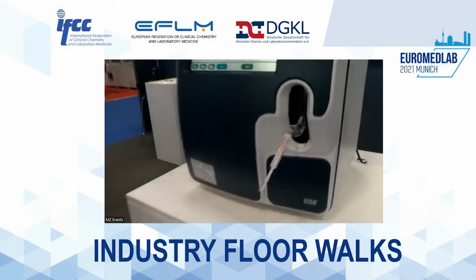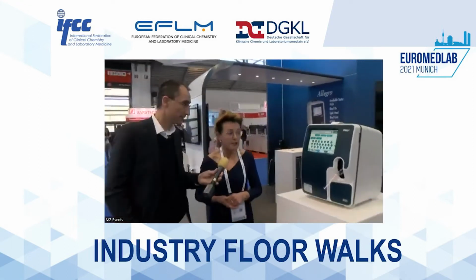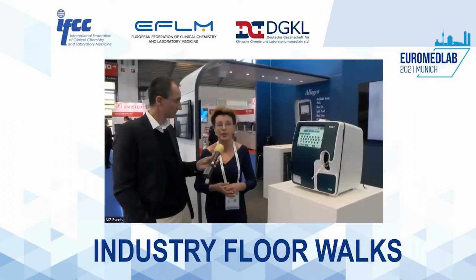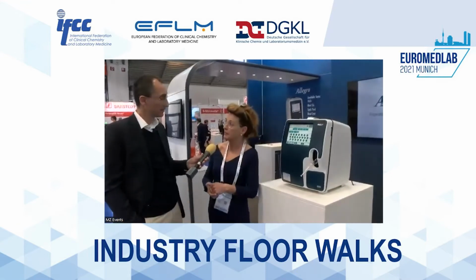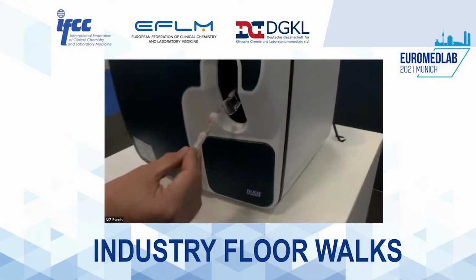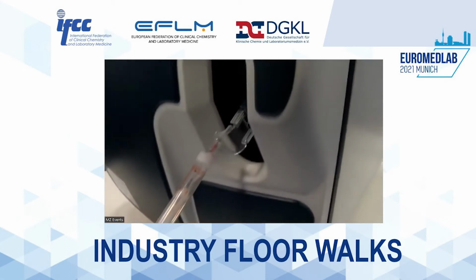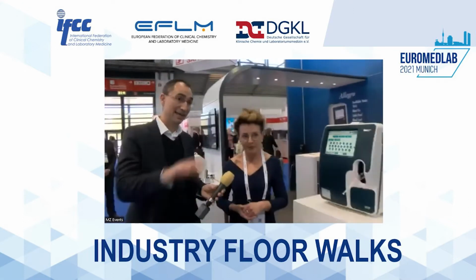Exactly. So can you tell me a little bit about the specimen you can use for this analyzer? It's made for whole blood samples, venous or capillary samples, arterial samples. That's good to see. Okay, and I think you're using a standard specimen like it is over here, heparinized blood gas monovettes. Yes. Okay, I understand.